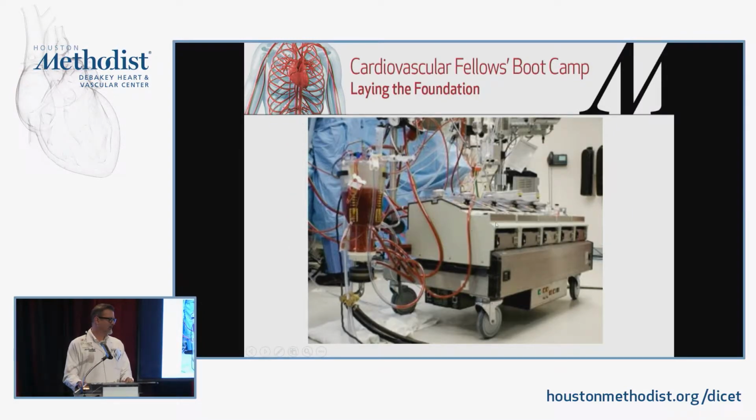There's a better picture of it here. So these are the pumps that DeBakey invented up here. The centrifugal pump is actually very small nowadays. It's like this big. Here's the venous reservoir oxygenator, and then down here is where the heat exchanger is. And you know that because these big black tubes fill with water, and they go back over here. It's a machine. It's amazing. We just got a new one where I am. It's about as big as a box, and it sits over the side. It makes the most noise of anything. But you can change the patient's temperature by telling the perfusionist, go up, go down, I want to be at 35, whatever you want. So the water comes through here, it doesn't touch the blood, but it warms or cools the blood, whatever you need to do.